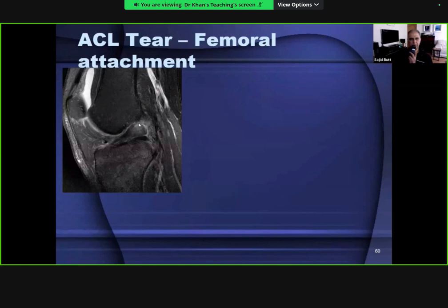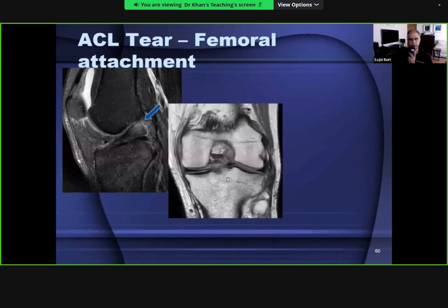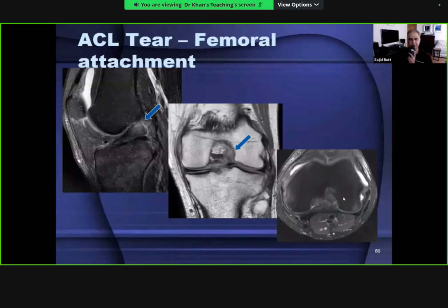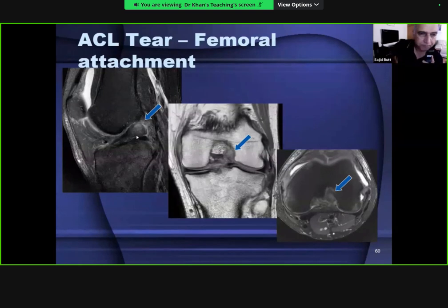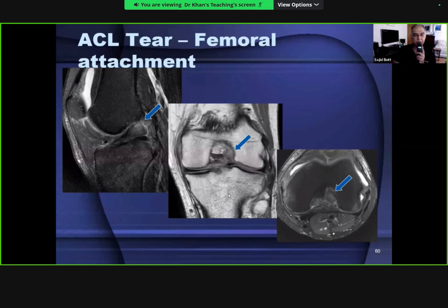The femoral attachment of the ACL is more commonly torn. Once torn, the ligament fibers sag within the intercondylar notch, showing a flappy and horizontal rather than normal taut appearance. See them in all three planes. Sometimes radiographers have not aligned the sagittal imaging along the lateral femoral condyle, making the contour tricky - so it's good practice to recognize the cruciate ligaments in coronal and axial imaging in addition to sagittal imaging.